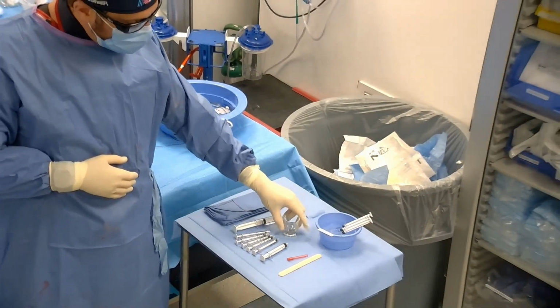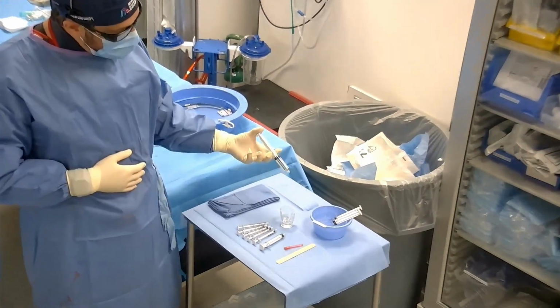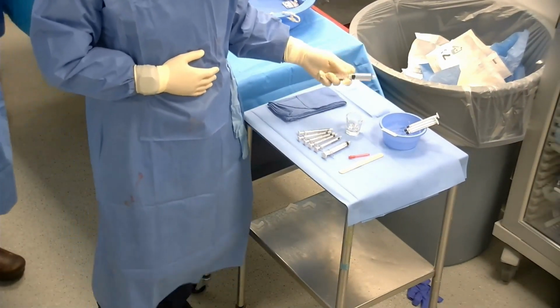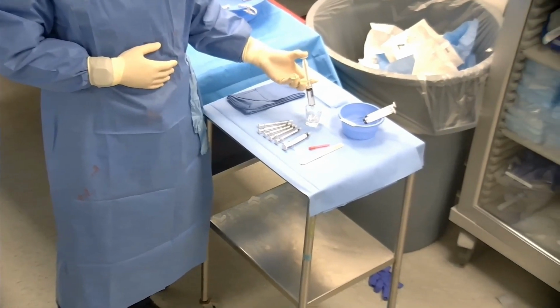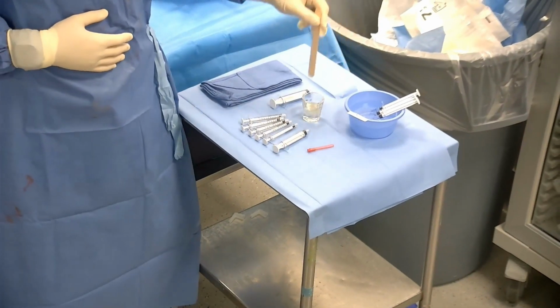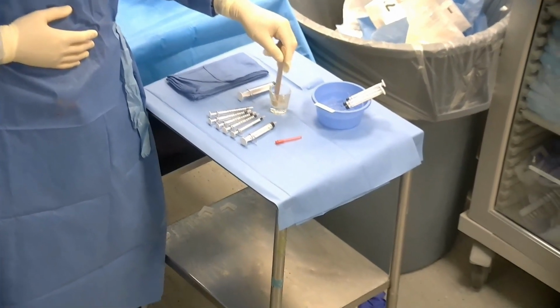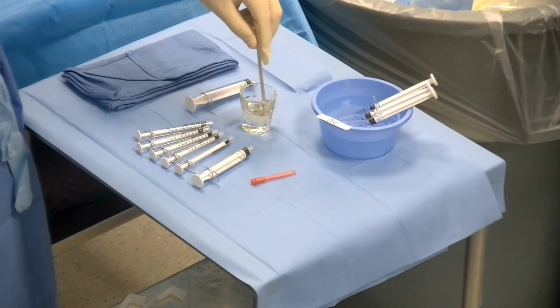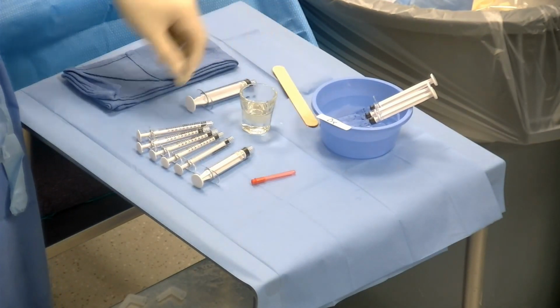In this shot glass, I have 1 cc of n-BCA. This is 10 cc's of oil, Lipiodol. So we're going to basically make it 10-1. I like to keep it 10-1. It just makes it easier. It's easier math, in groups of 10. That's just the way my brain works. So we mix it up, and that's it. That's our embolic.